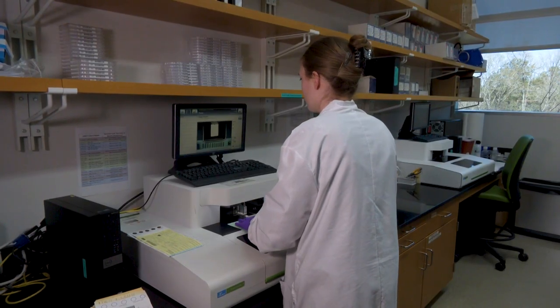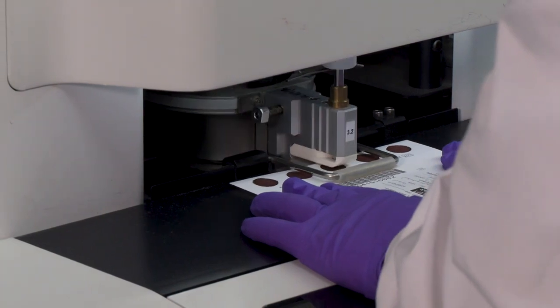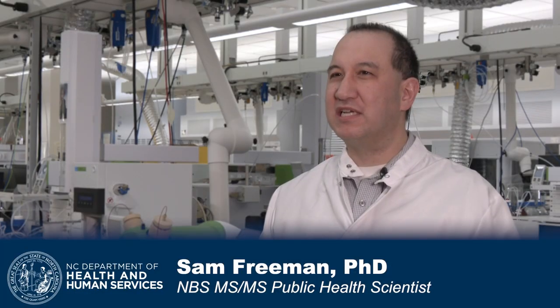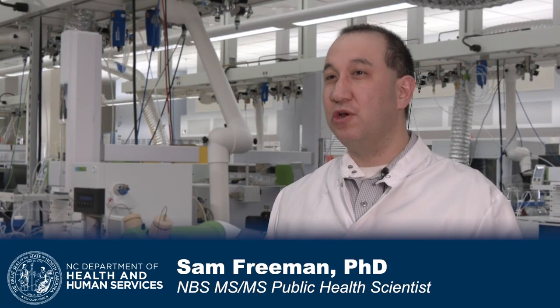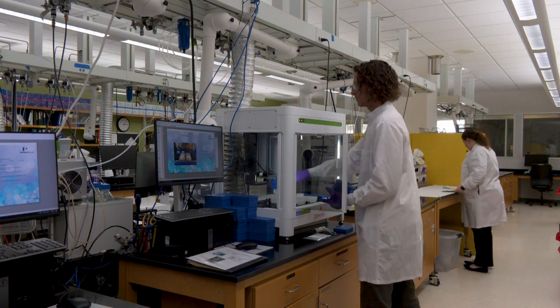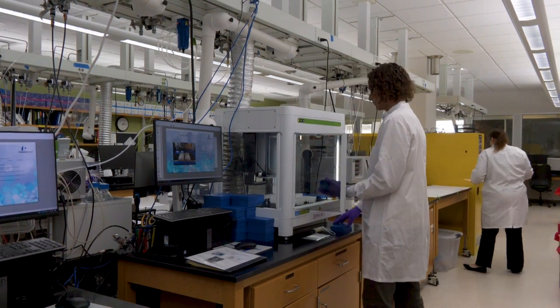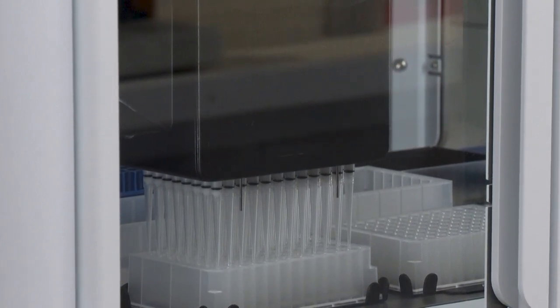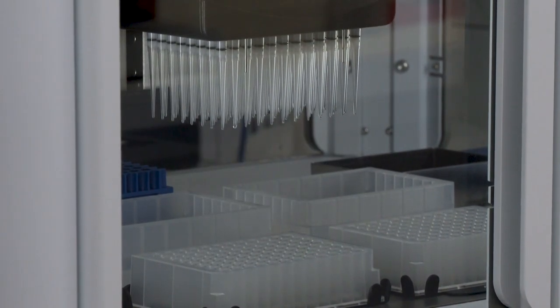After specimens are received in the laboratory, small sections of the dried blood spots are punched into trays for all the newborn screening tests. Trays of specimens are tested by different groups in the newborn screening laboratory. The Tandem Mass Spectrometry Laboratory tests newborn screening specimens for a variety of metabolic disorders. Tandem Mass Spectrometry is a technology that uses instruments to test dried blood spot specimens for specific metabolites that are produced when the body breaks down sugars, proteins, and fats.